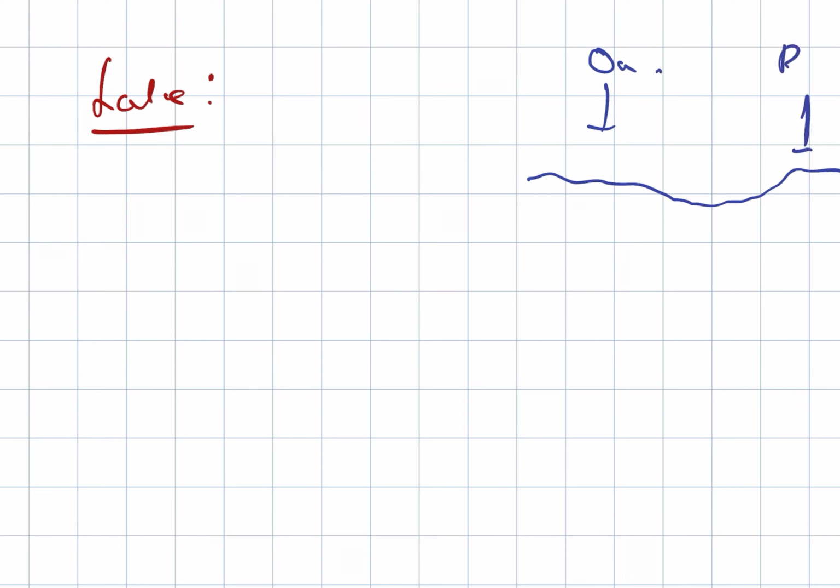Next, we are going to look at the late. So this is in relationship with the contractions. Firstly, we have this diagram. As we know, this is the onset, this is the recovery, and the dip, this is the nadir. And here what we are seeing is the contraction happens prior to the nadir.